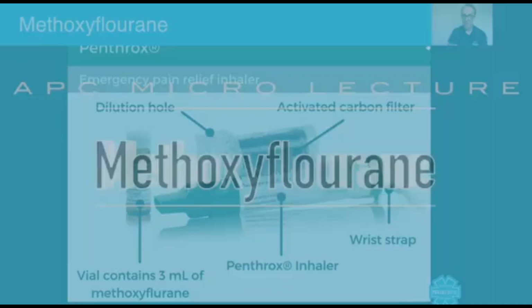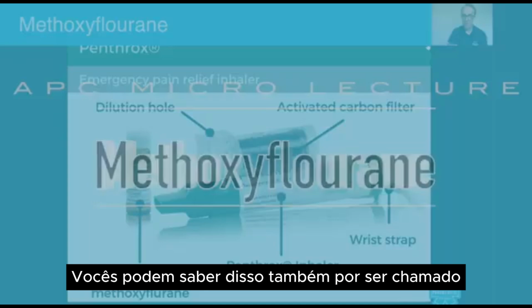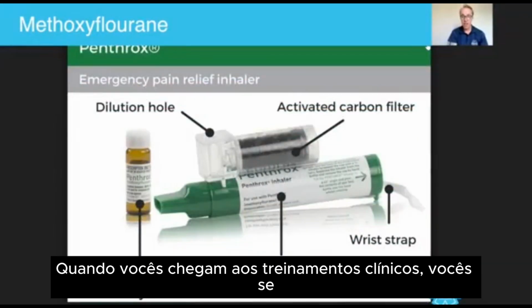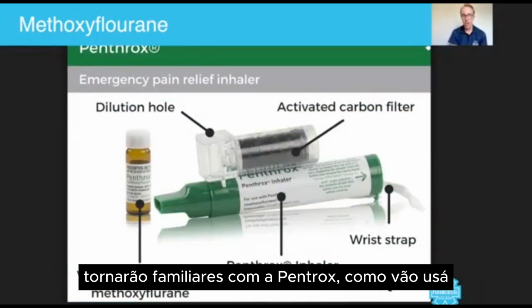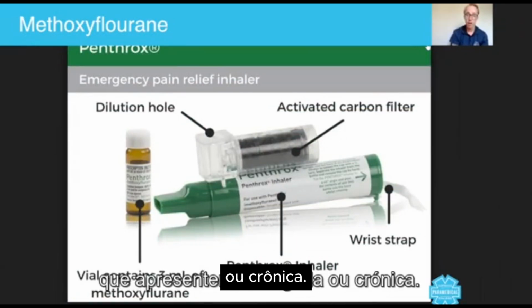Hey everyone, let's talk a little bit about Penthrox. You may know this also to be called methoxyflurane. Now when you get to the clinical workshops, you will become familiar with Penthrox as you will be using it to treat patients who present with acute or chronic pain.